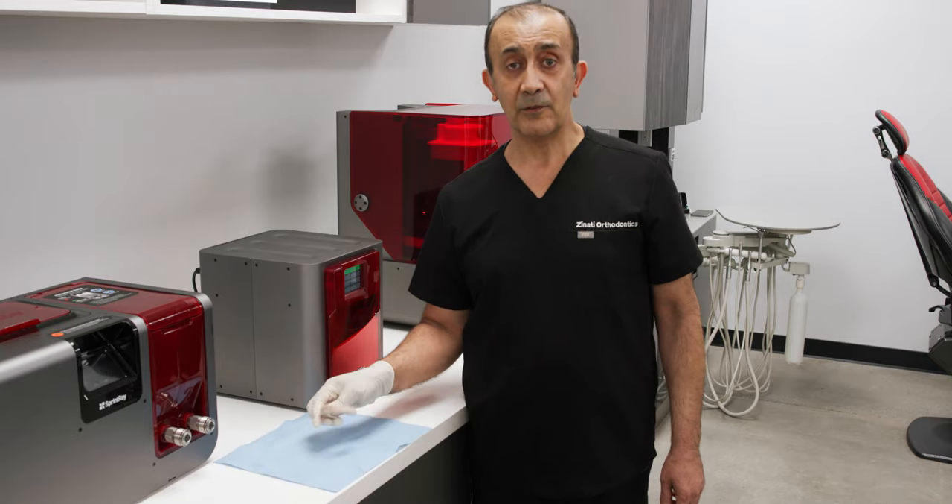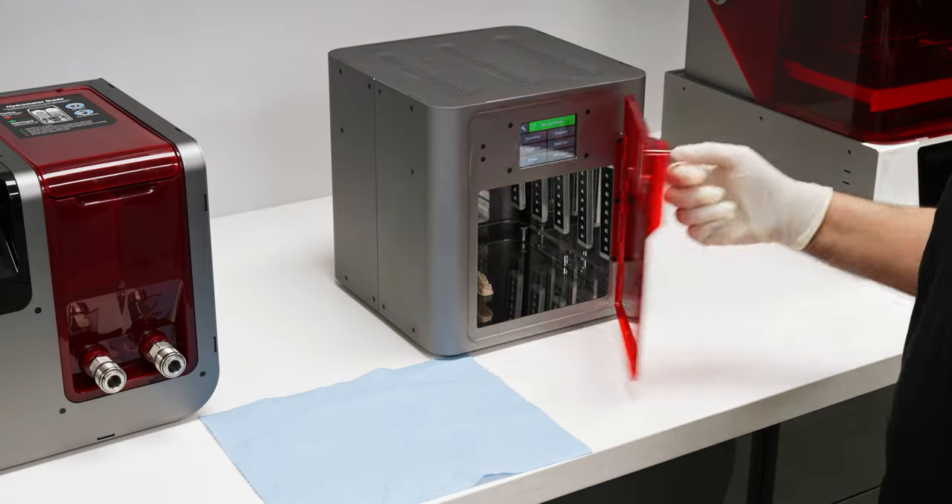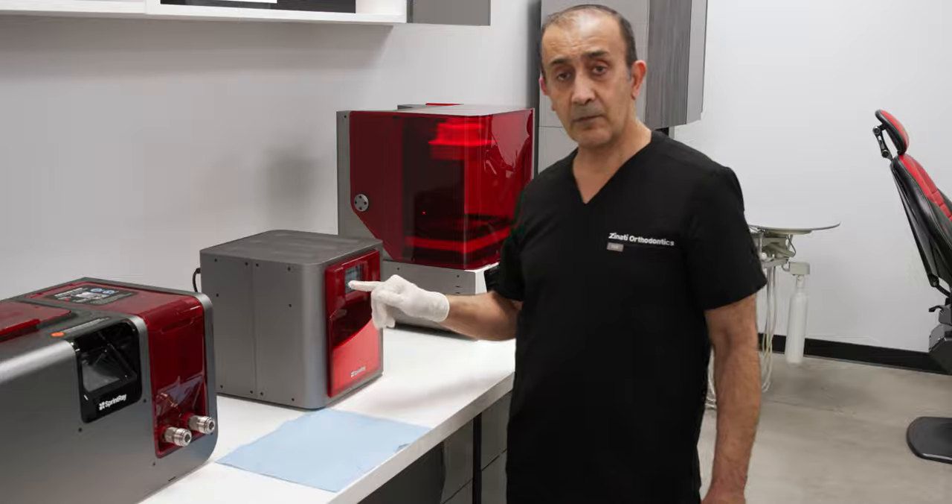The next step is to put the model through the Pro Cure. This is a very simple step — just make sure you have the right settings. Most of the time I use model setting 10.